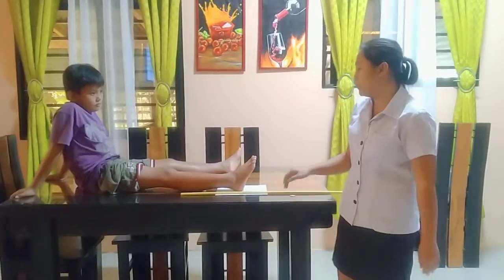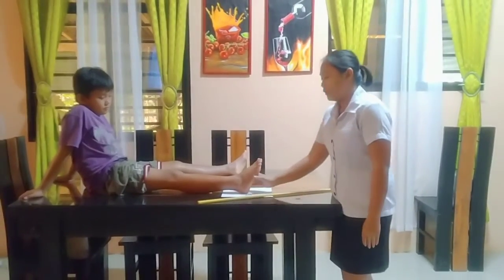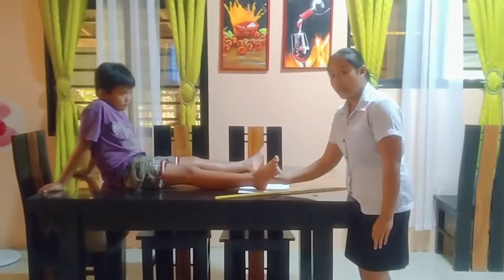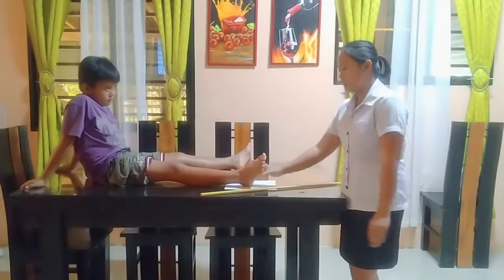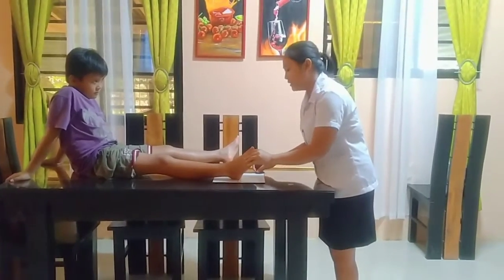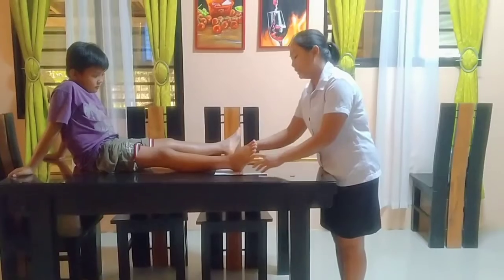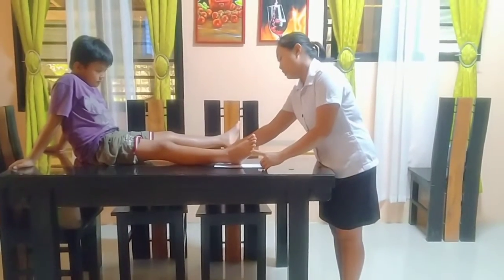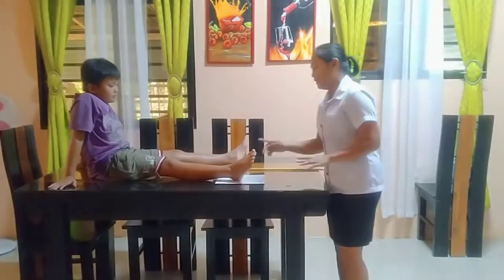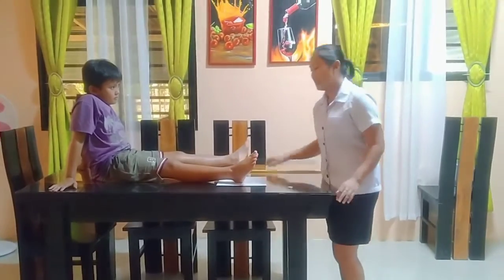Now, next projection will be the apiaxial oblique lateral rotation. So, ang pinakaiba lang po nila is i-rotate po natin ang foot ng patient 30 degrees lateral. Dito naman po. So, the central ray will be directing 1 inch posterior to the malleolus.